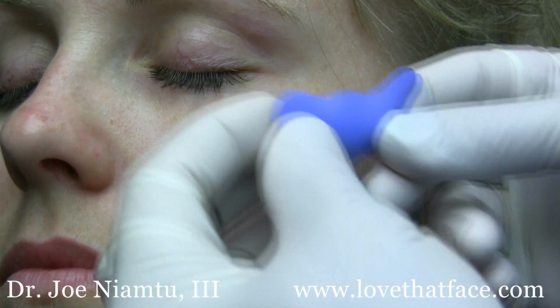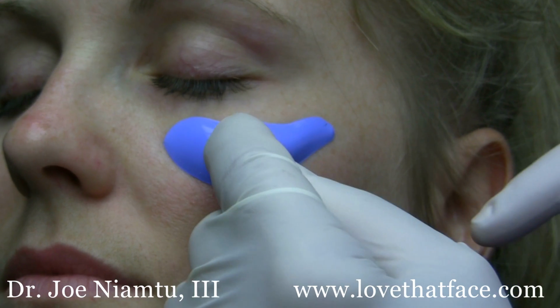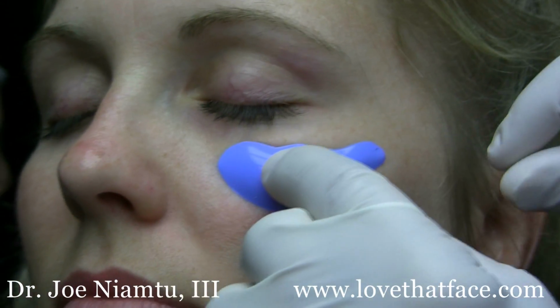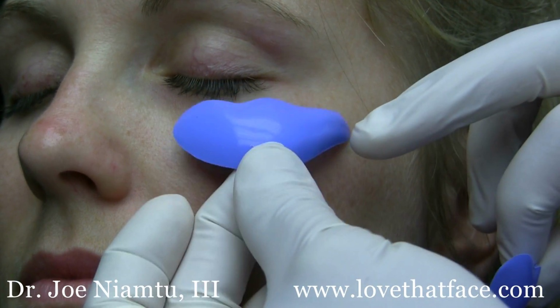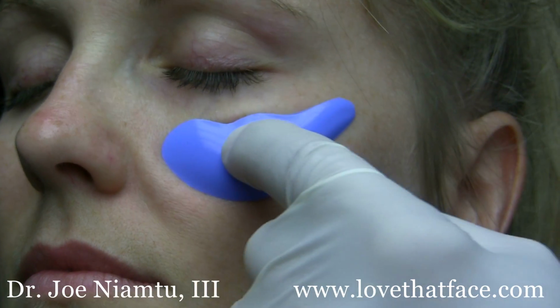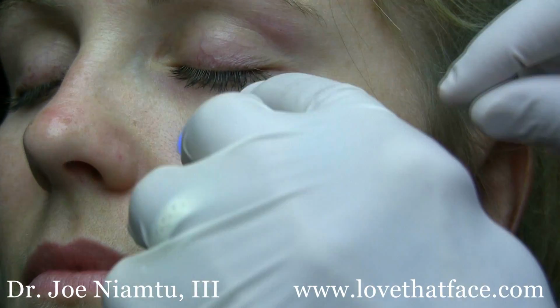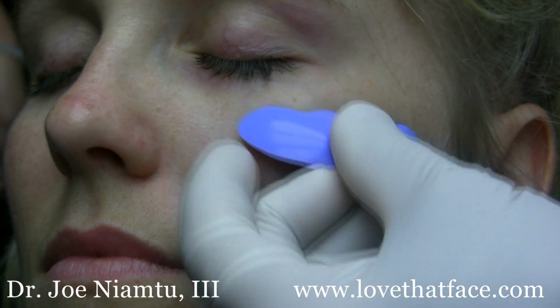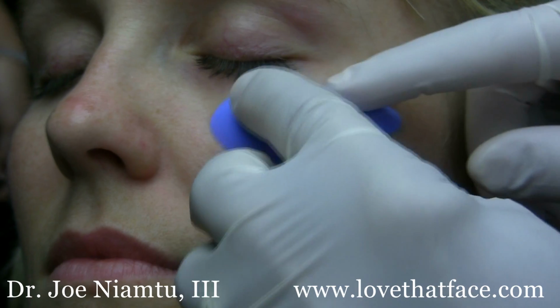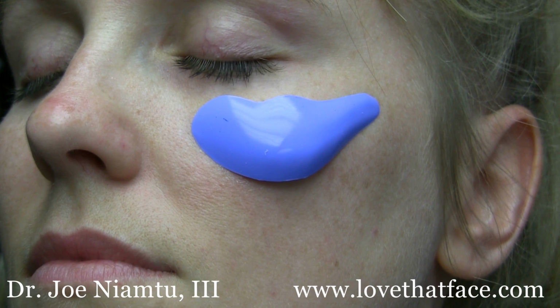So again, my go-to implant for the average patient is the submalar implant. This is what most patients, male and female, will benefit from. A smaller, more petite patient or a younger patient may need that type of size, where an older patient with more volume loss may need that type of size. So these are made by Implant Tech. These are silicone implants, and these are just the sizers. The actual implant is clear, and you can actually try these in during surgery just like you try on shoes. So this is just a little insight of how we choose implants and what implants we choose.